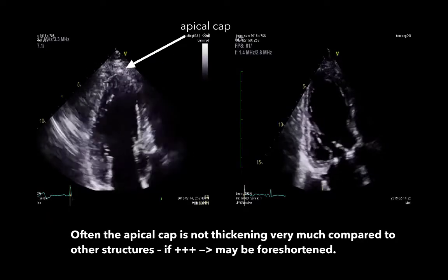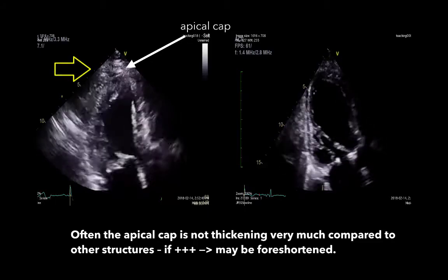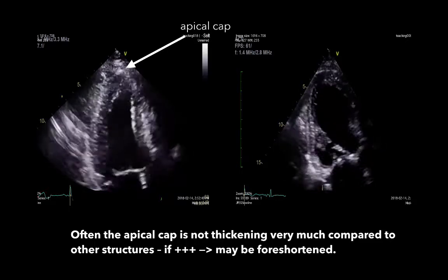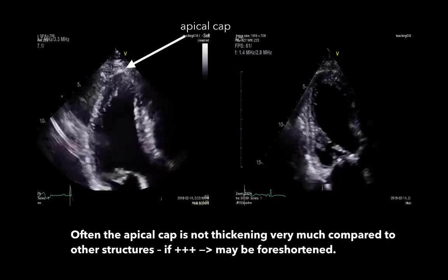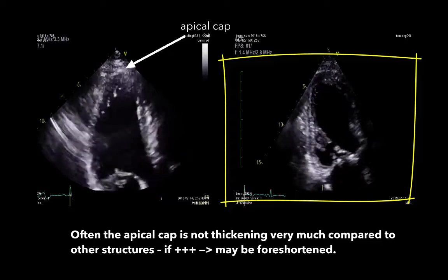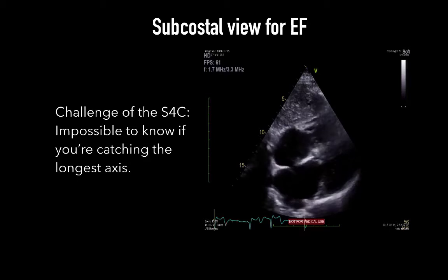To avoid foreshortening, always attempt to obtain the longest view of the ventricle and ensure the apical cap or apex is not moving, as seen on the left clip. The apex should be the anchor of the heart during echo assessment — it should only thicken and not move in space. Its contraction is usually the smallest of all LV segments and appears as the thinnest portion. The right clip shows a moving, thickening apex that changes with every contraction — this is not the true apex. Foreshortening also makes the subcostal four-chamber view challenging for LV assessment.